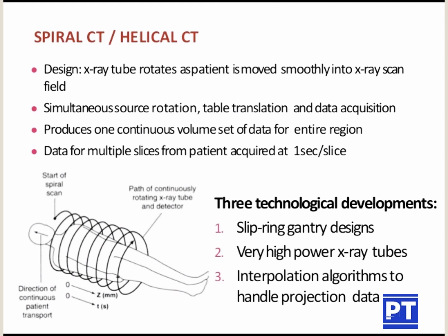Why it is happening is due to the slip ring technology. The slip rings are inside the gantry, which helps the continuous rotation of the X-ray tube and the detector around the patient. Very high power X-ray tubes. Interpolation algorithm to handle projection data.